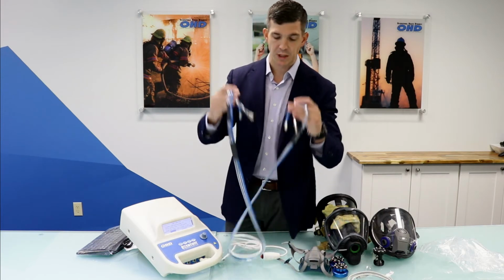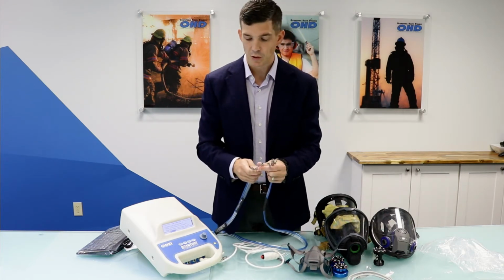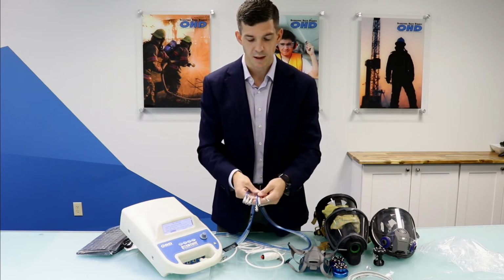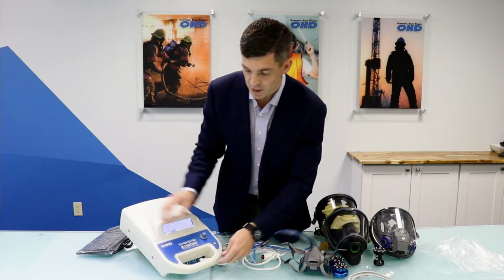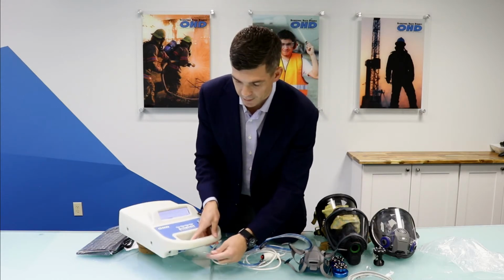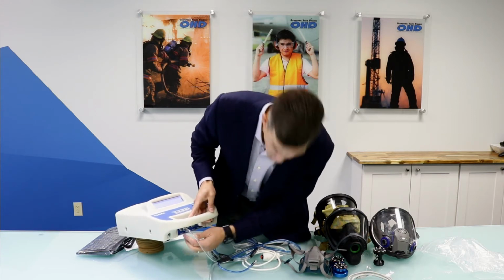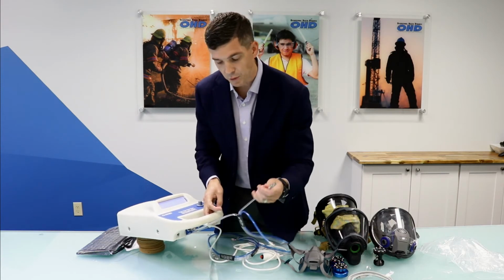The next thing we'll do is connect our triple tubes. These tubes are very easy to connect up to the instrument. There's a few ways to know how to do it. The first way is 6 connections, 5 of which are female, 1 is male. So the only place on the instrument that this connection will connect is on the one female receiver here, and that is your flow tube. Then you have pressure across, and these are labeled as well.